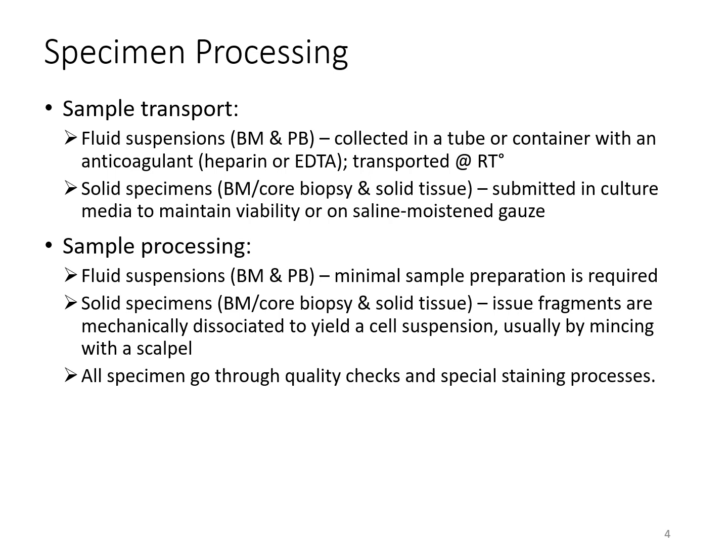Now, as far as processing them, anything that's in a fluid suspension is going to have very little processing required, other than if you're making any sort of special stains. With flow cytometry, it's not really going to require a whole lot of processing.